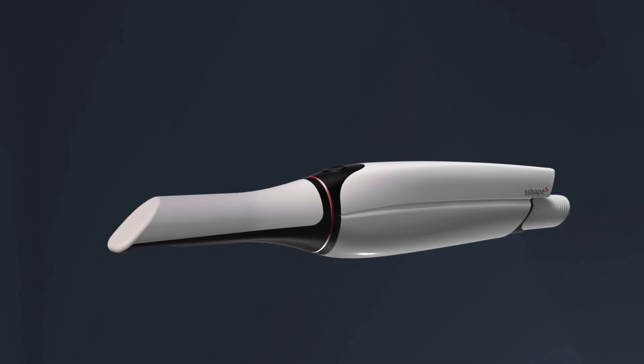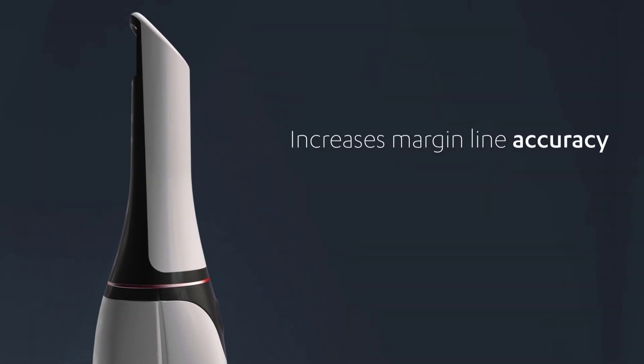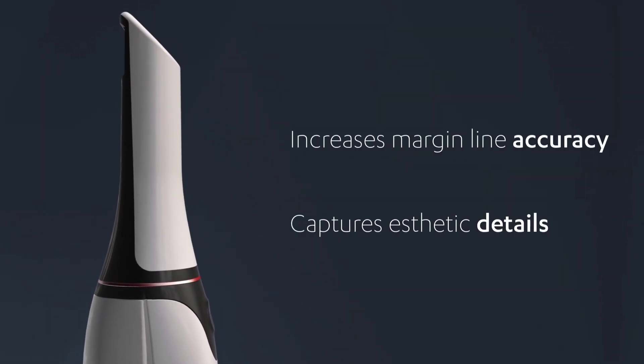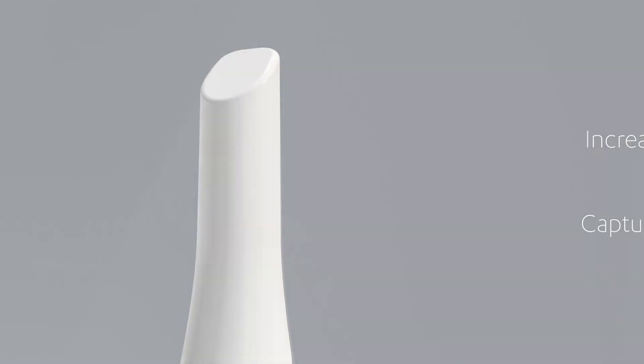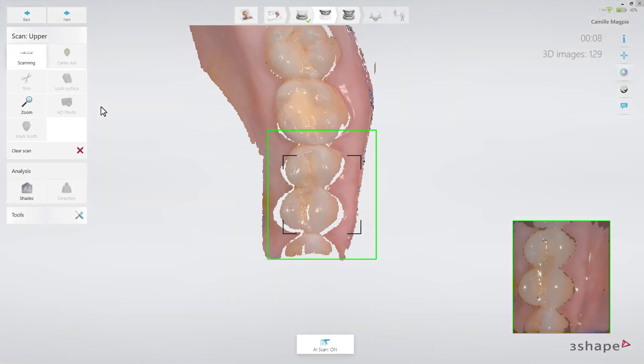The HD Photo function increases the margin line accuracy and captures aesthetic details, which is a huge advantage for the lab. Start by scanning the arch as usual.